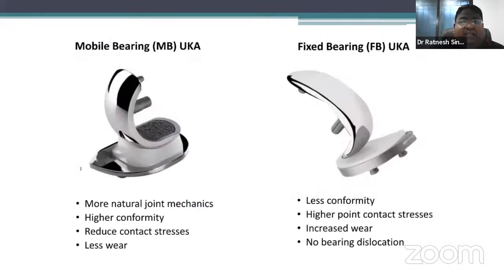Now coming to the implant design, mobile bearing UKA. The movement is more natural.